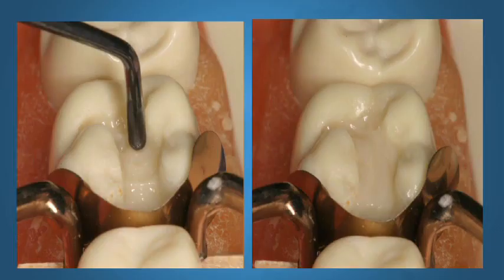I tend to wet my instrument with a little unfilled resin, because it doesn't matter what material the instrument is made out of, it still sticks a little bit. When I wet my instrument with unfilled resin, I just barely wet it. I don't want it dripping, because if it's dripping, then you're watering down your composite. If you use alcohol, that's a mistake, because alcohol is a solvent. It's going to start dissolving your composite. So alcohol is not a good choice. Unfilled resin is a good choice, but not very wet.